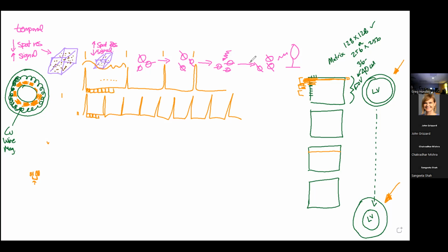We keep these group sizes really big. We won't have the temporal resolution. You can have a choppy image, right? Instead of this smooth one, you're going to have something where you're captured here, and then here, and then here, and you could miss systole. People can see my hands here, but it's going to be a choppy image. You got here, and then here, and then here's systole. You're back here, you miss it.